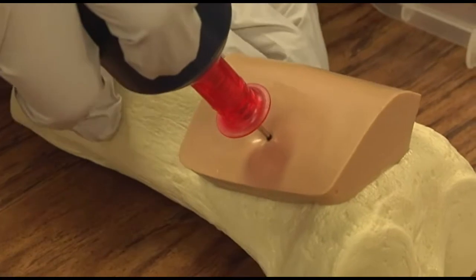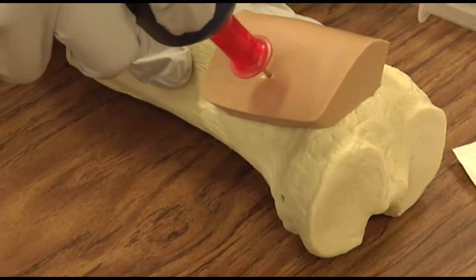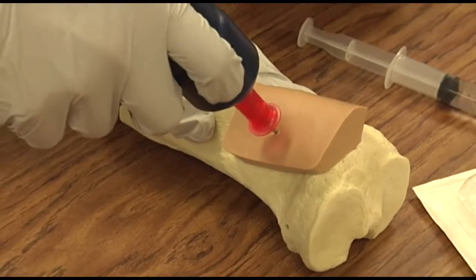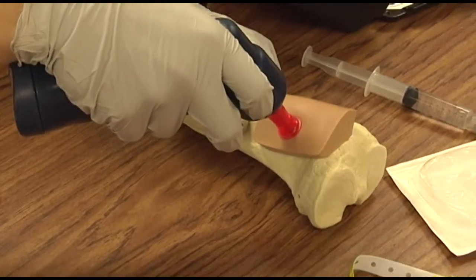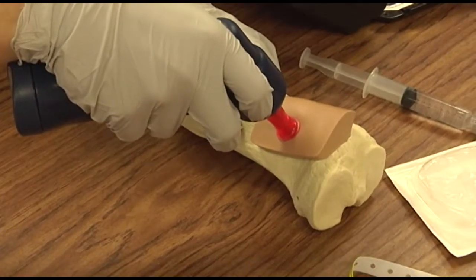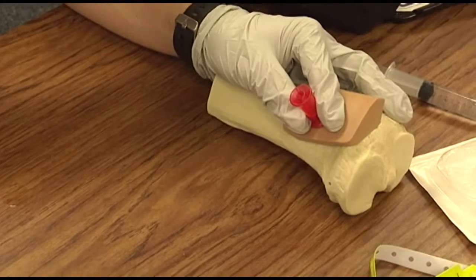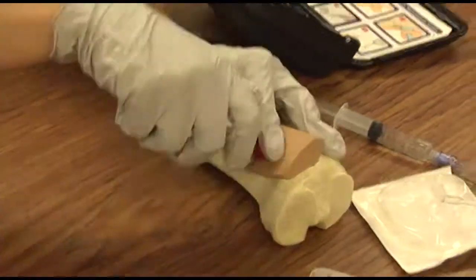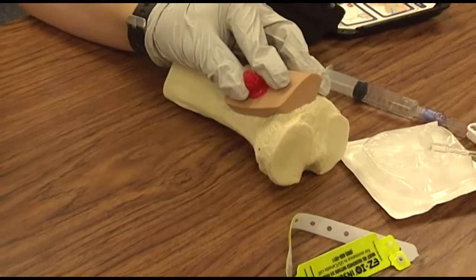You will then penetrate the bone cortex by squeezing the driver's trigger, and release the trigger when a pop is felt. Stabilizes the catheter and removes the power driver, then unscrews the stylet. The stylet will then go into a sharps container.